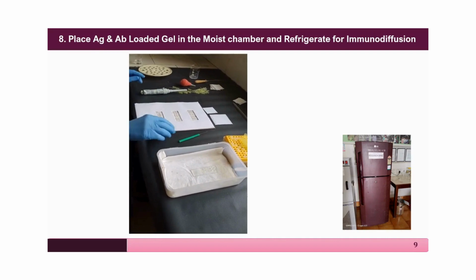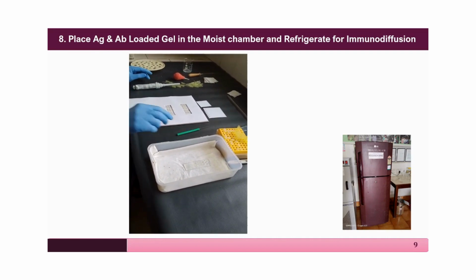Cover it up with a lid and keep it back in the fridge. Once again, not in the freezer. It should be in the bottom portion of the fridge. And leave it alone overnight. Next day, come and observe the slide.